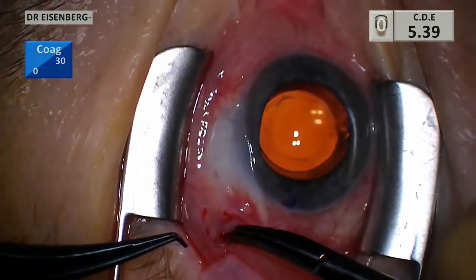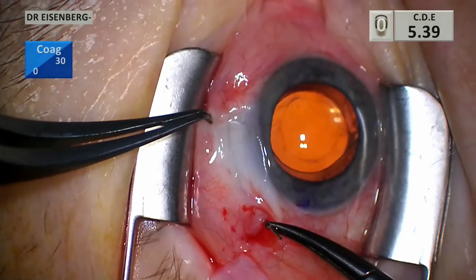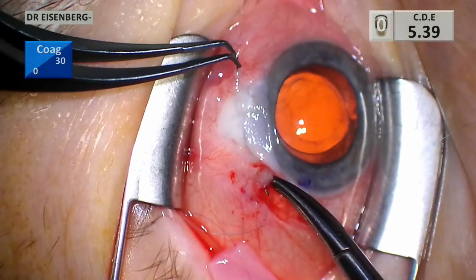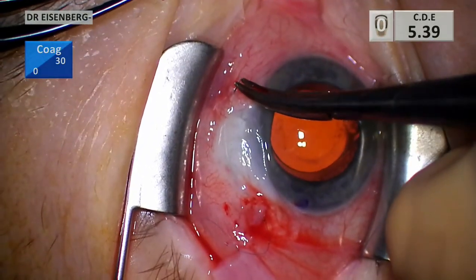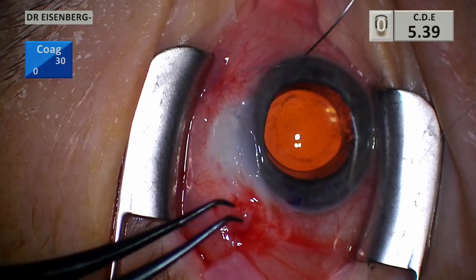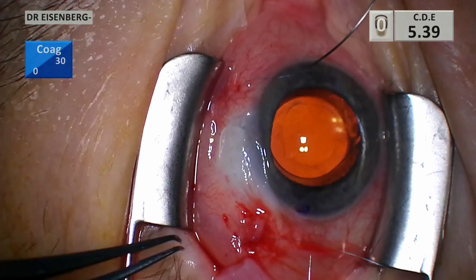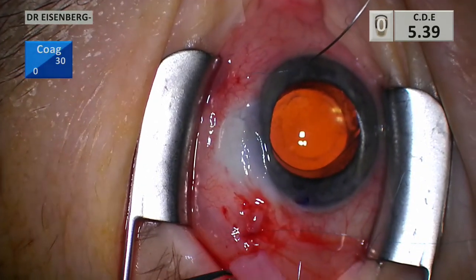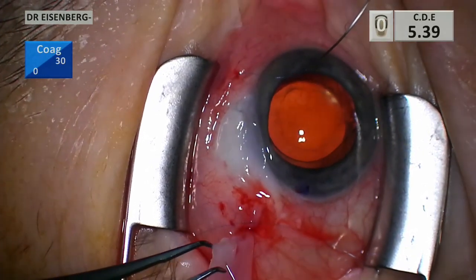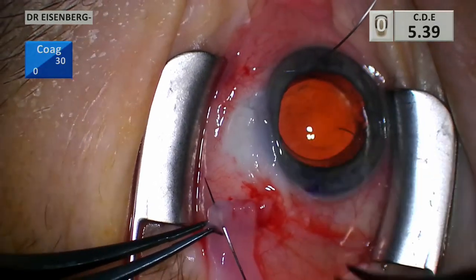This technique will seal the bleb and will definitely keep it functional, but as far as growing new vessels, it really won't do that to any great extent. Originally I was using conjunctival autografts on top of the bleb, then I went to amniograft on top of the bleb — never really liked that; never thought it worked very well, and it's extremely tedious. Not sure what got me to put the material subconjunctival, but this works amazingly and I've been doing this for a long time with almost none of them failing.